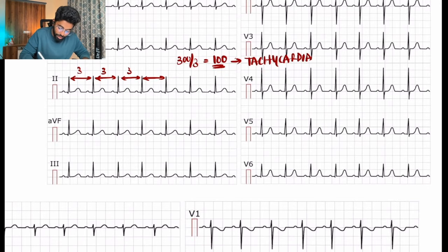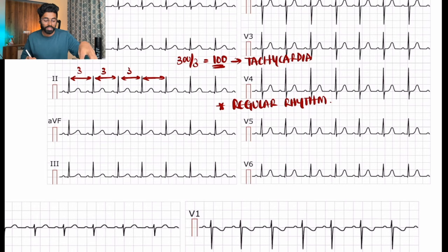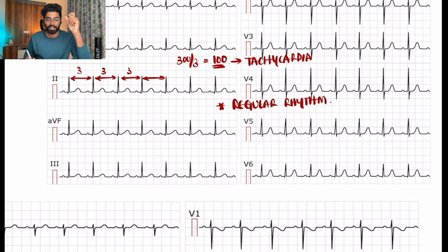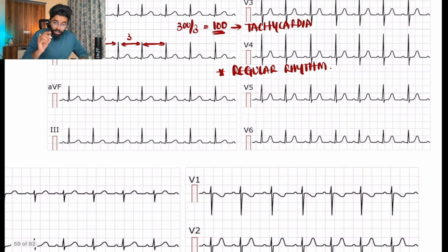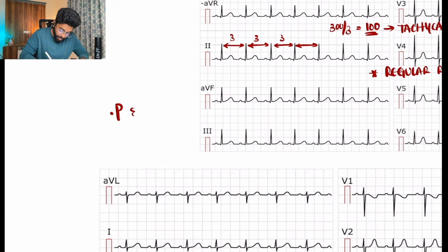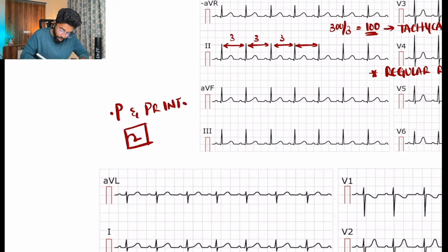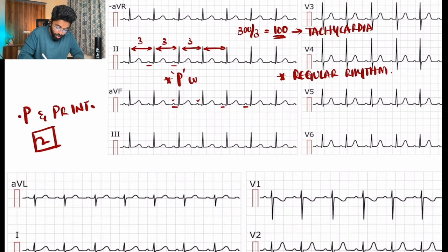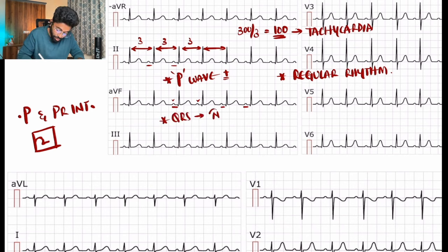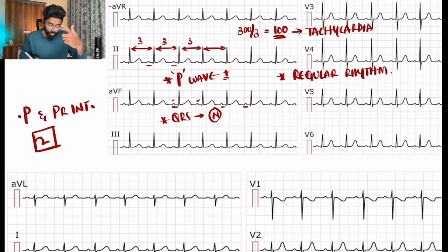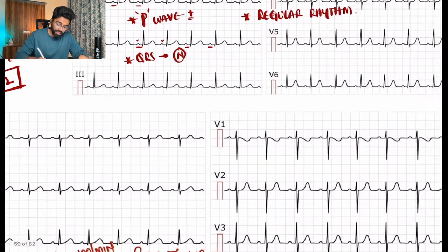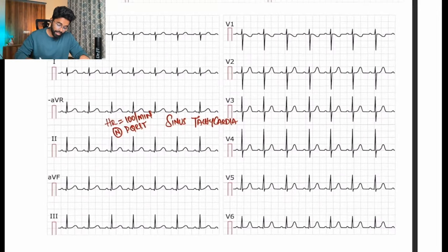Next, assess rhythm — is it regular? We look into the P wave because if a P wave is present and its morphology is normal, and the PR interval is also normal, then we can say there is a normally functioning SA node and normal conduction from SA node to AV node. A key reminder: P wave and PR interval should occupy only half of the large box. If P wave is present, SA node function is normal; if PR interval is normal, conduction is normal; and if QRS complex is normal without any narrowing or broadening, this ECG represents sinus tachycardia.